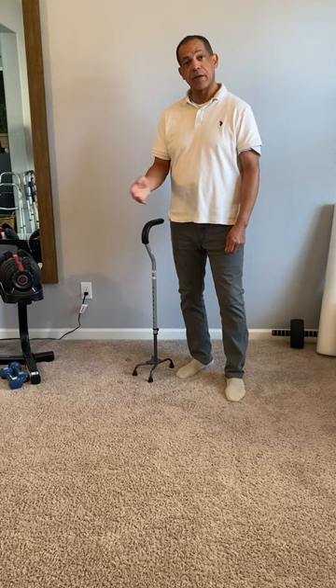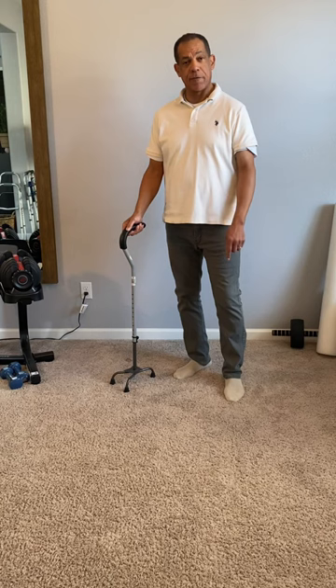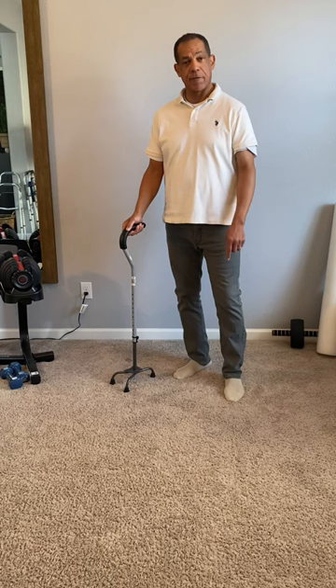When you're walking with a four-pronged cane, you want to use it in the opposite hand of your sore or weak leg. That way, when you put the cane out, you step forward with the bad leg, then bring the good leg forward. This gives you the most support and takes a lot of the pressure off of the painful or weak leg when you're walking.